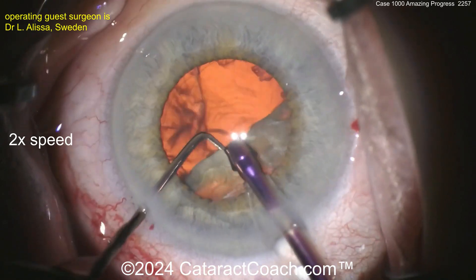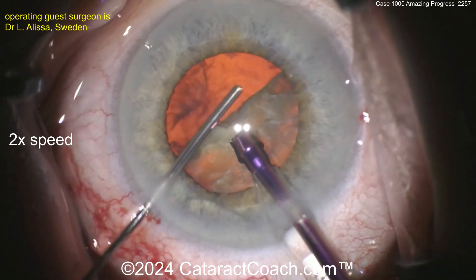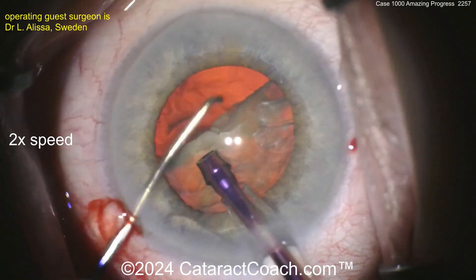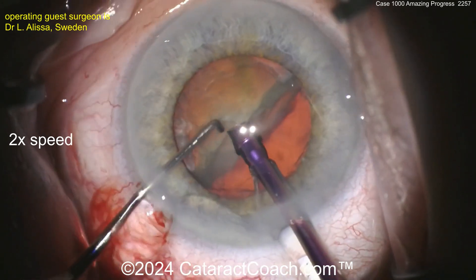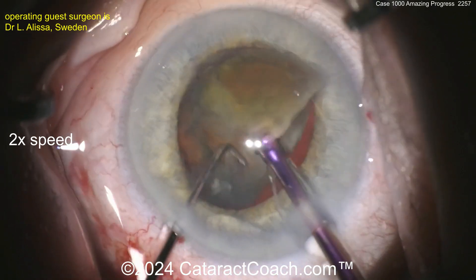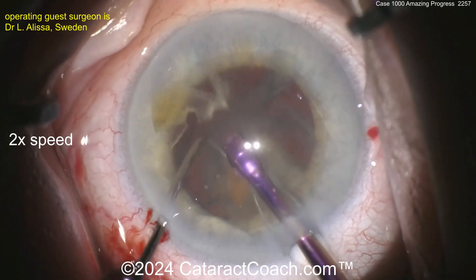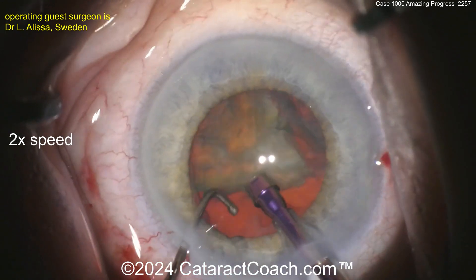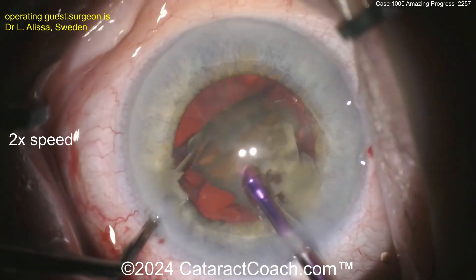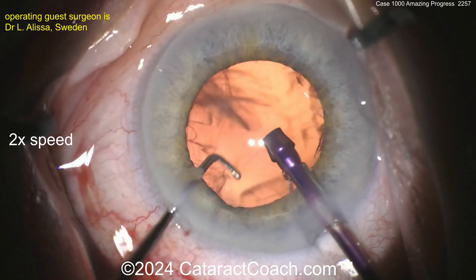We know the young generation who watch these videos want it fast. Half the nucleus is out of the bag — recoating the endothelium and filling the bag with a little viscoelastic, pushing the posterior capsule back. Now get this piece rotated, buzz in the middle, and there's another good chop. There's something very satisfying about doing FACO chop. I promise if you learn chop, you'll never go back to divide and conquer — it's such a fun, efficient technique.